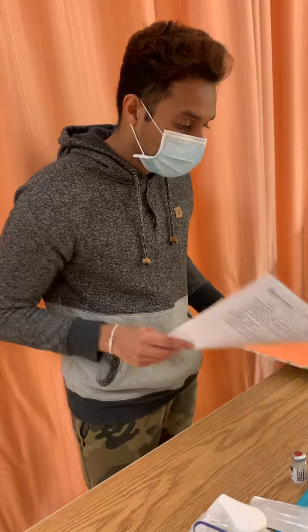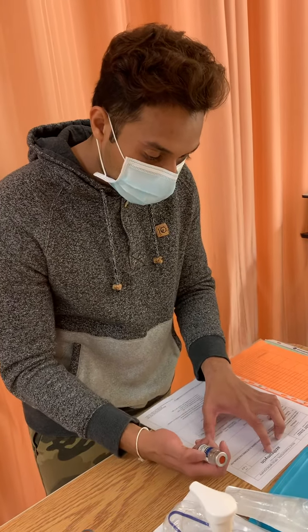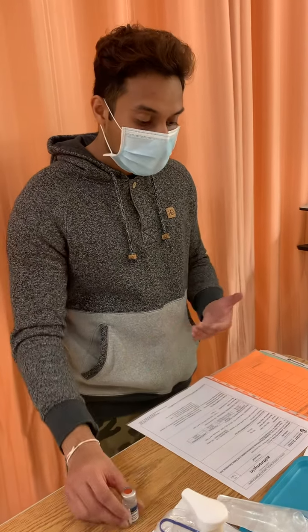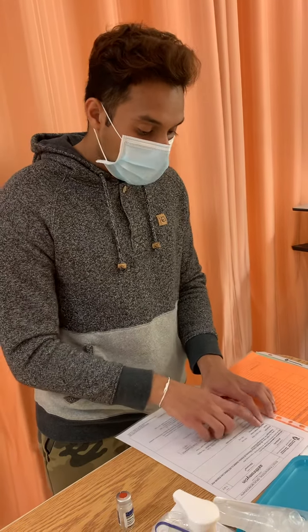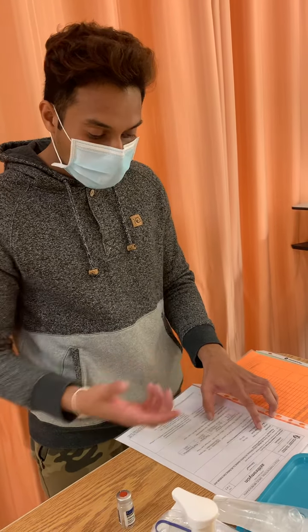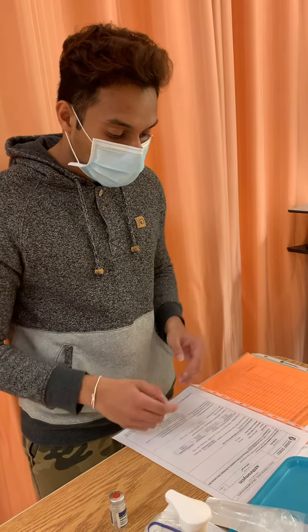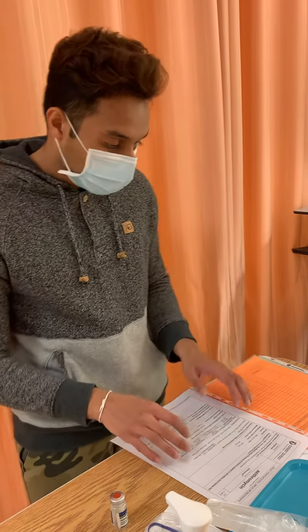And we're just comparing this with the parenteral drug monograph. So we have the medication here, Azithromycin. It's an antibiotic. The reason we've given this medication is to treat the patient's cellulitis. We see the student nurse can administer the medication, so I can administer it. The usual dose is 500 milligrams IV daily. We're within the dose. The maximum single dose is 500 milligrams, and we're giving 500, so we're safe there. The maximum daily dose is 500 as well, so we're within that range too.